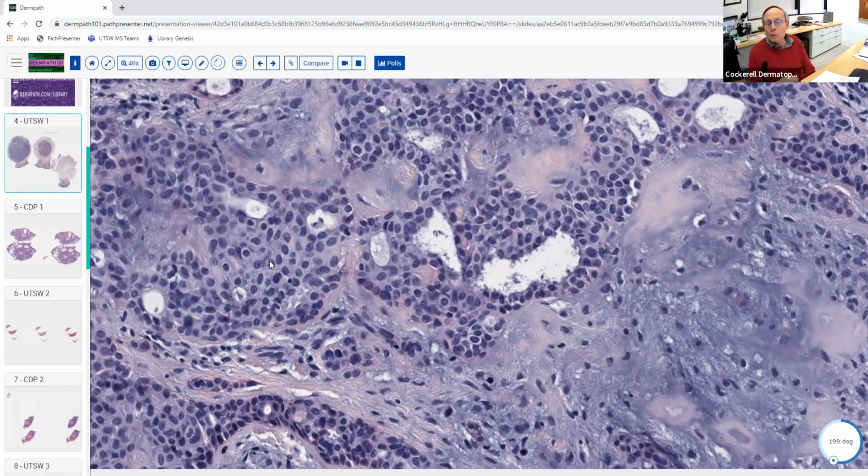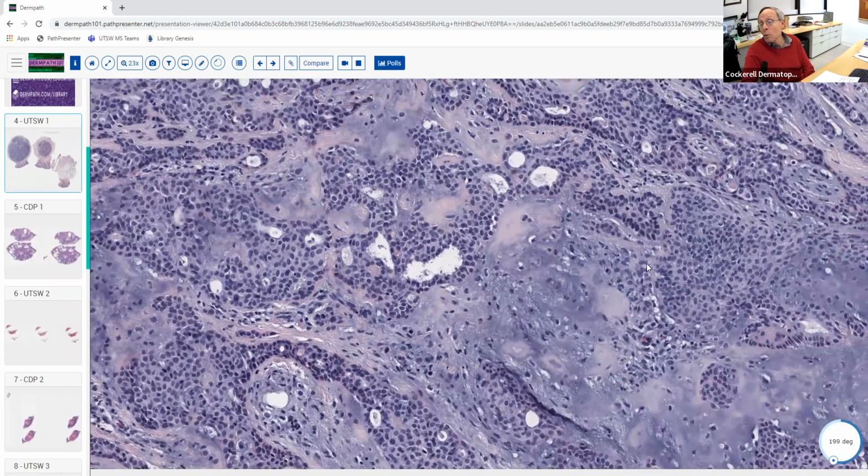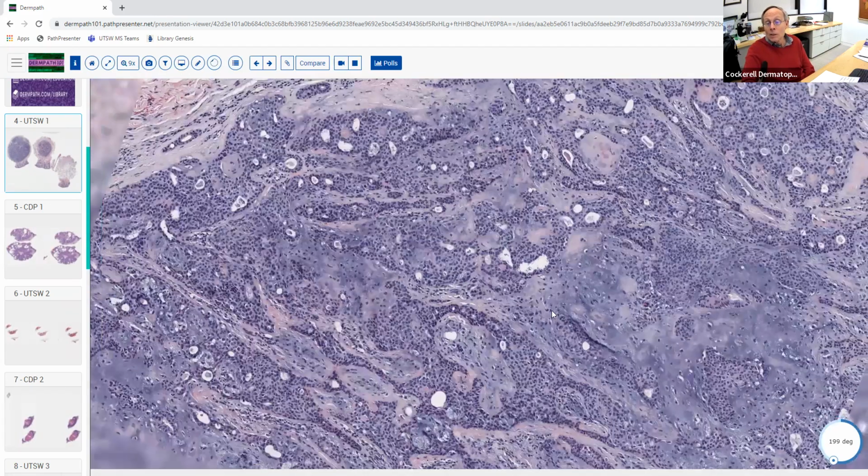So your sweat, actually, when it reaches the surface of your skin, is hypotonic, but it tastes salty because it still has some small amounts of ions in there, sodium and potassium and whatnot, and it dries and it gets concentrated on the outer part of your skin. But if you actually go in and look at the sweat itself, it's hypotonic. Sometimes they ask that on the board exam, interestingly enough. So this is a mixed tumor.